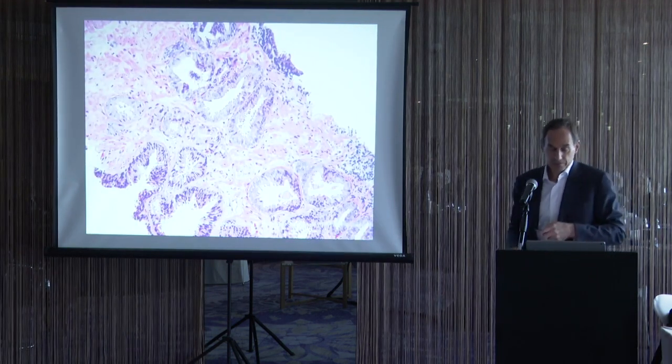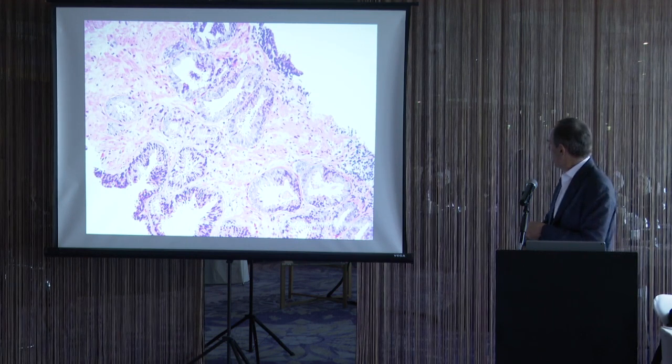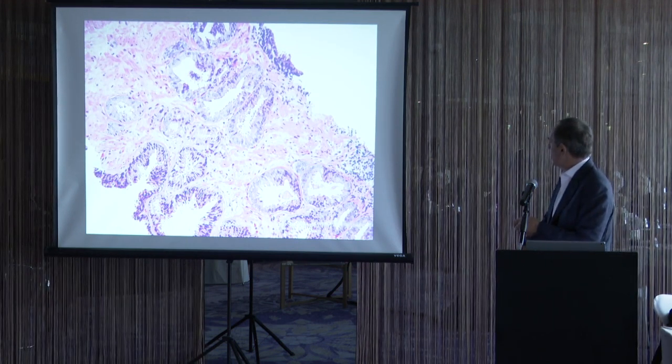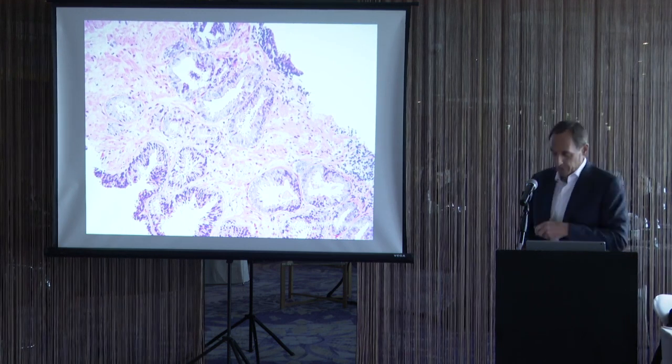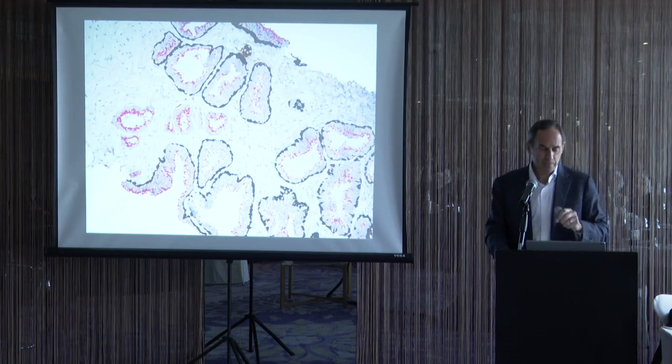Here's another case where you have a lot of high-grade PIN. All of these bigger glands are high-grade PIN. We see a small cluster of small glands. Is this cancer with PIN, or could this be outpouchings of PIN? And we do the stains.